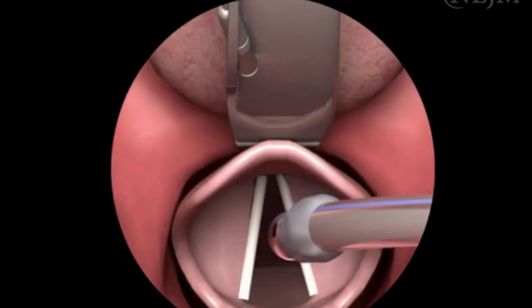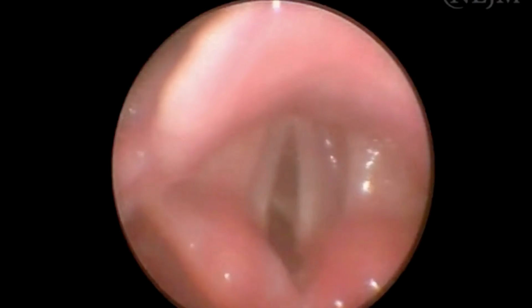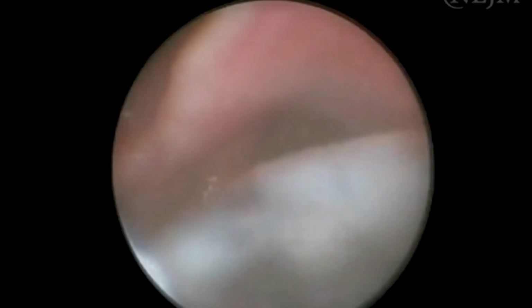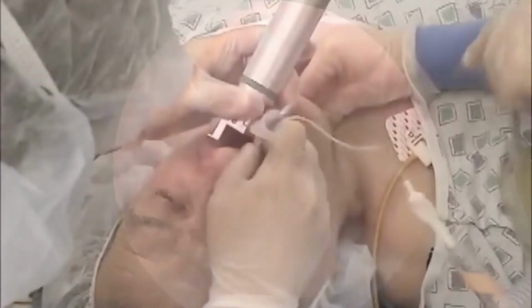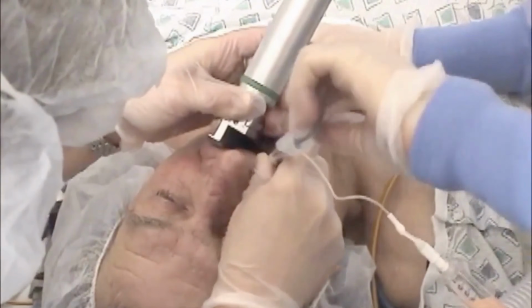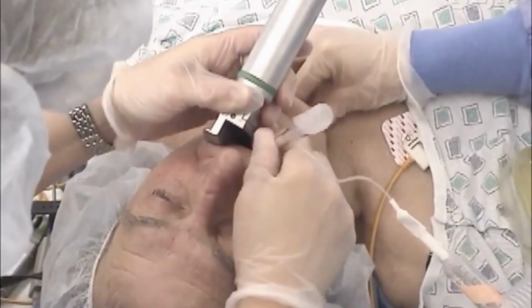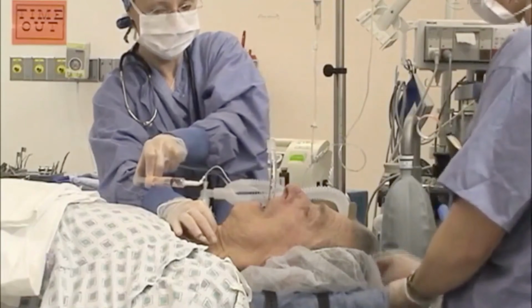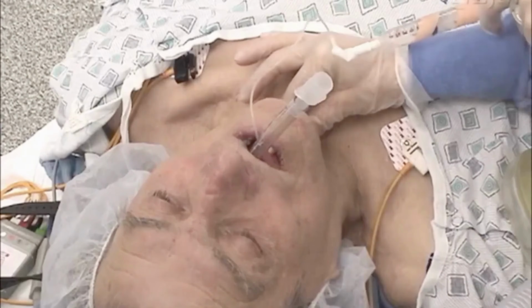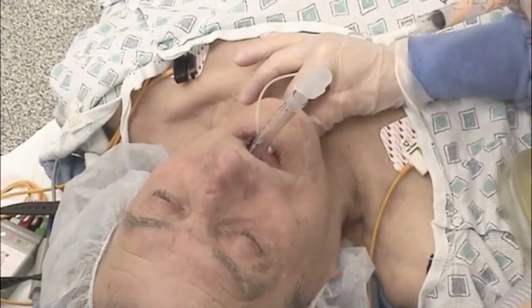When you see them, pause. This is where many intubations fail because of rushing. Advance the endotracheal tube under direct vision. Pass it smoothly through the vocal cords. Stop once the cuff has just passed beyond the cords. Inflate the cuff. Ventilate the patient. Confirm placement using chest rise, auscultation, and end tidal CO2.